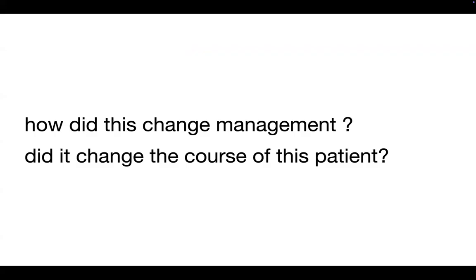The point is that we're using this technology at the point of care. So, we're using this almost like the stethoscope was used initially, right? We're using this to make physiologic assessments, is the better term, that can pinpoint which way we're going. And so with this case, clearly big liver, big heart, there was something going on. So we put the probe on. There are a few other examples, I think, as this talk goes on, that we can look at of how specifically we have changed things for the better in terms of saving a life.